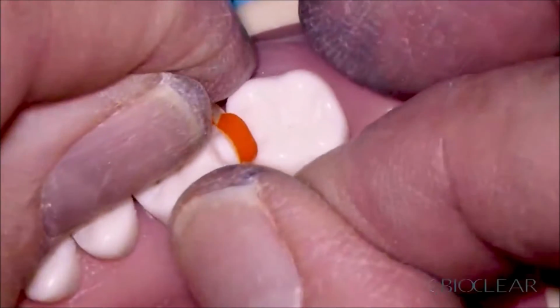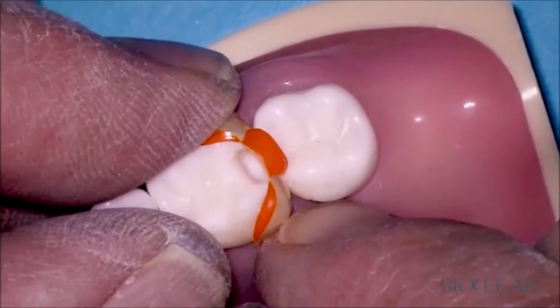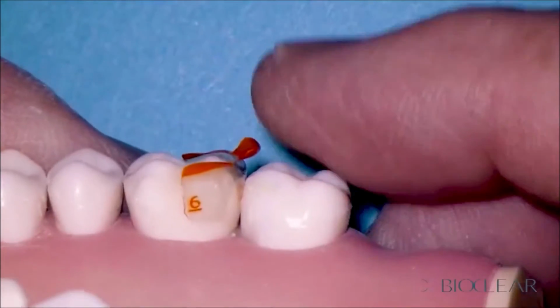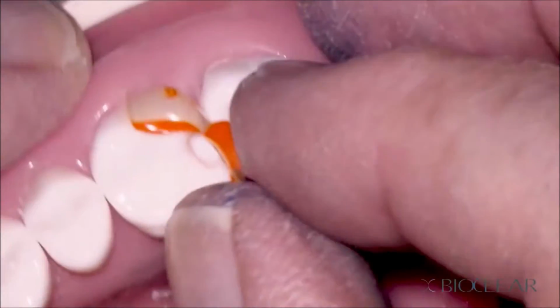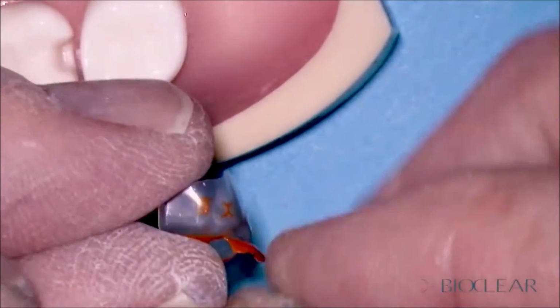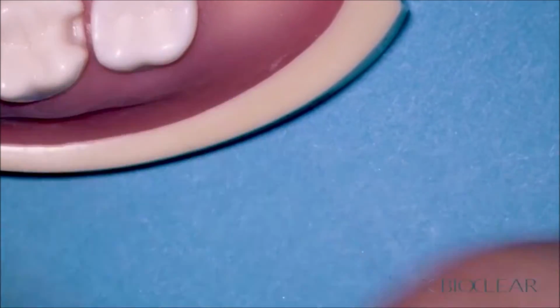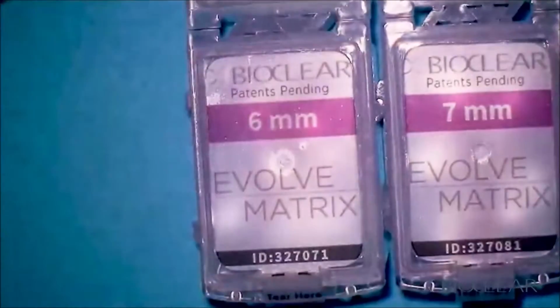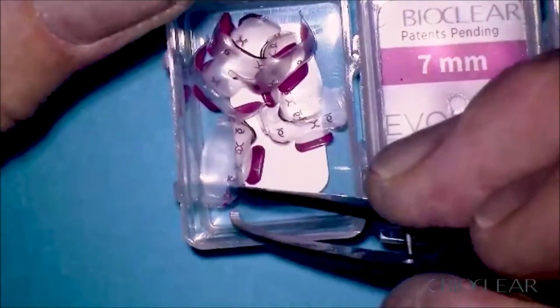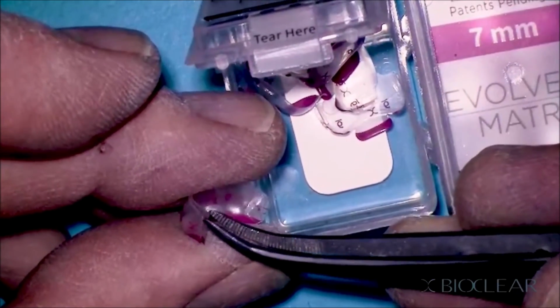That's a much flatter matrix. It's not inverting. It's a little bit tight because this is a large molar, but that would do. The matrix is not inverting because this matrix is very flat. It has a very flat emergence profile, unlike the blue. And then, if you have a very large tooth, which this one is, you could use the pink because this is the flattest of all the 3 emergence profiles, and it is also a larger tooth.